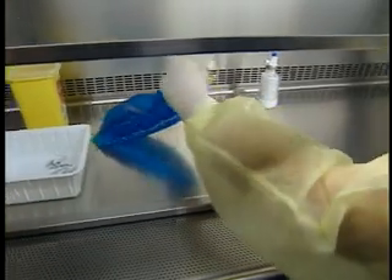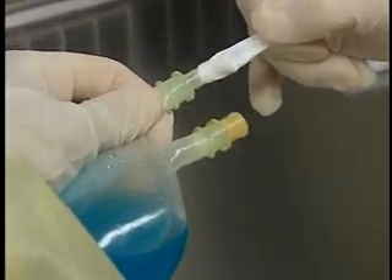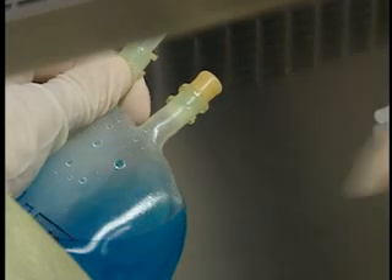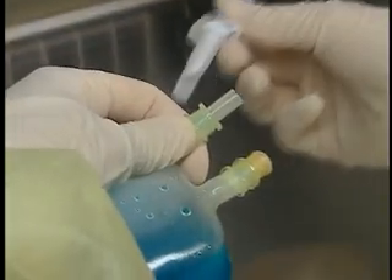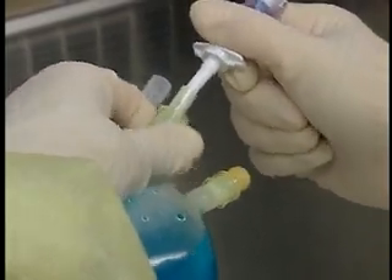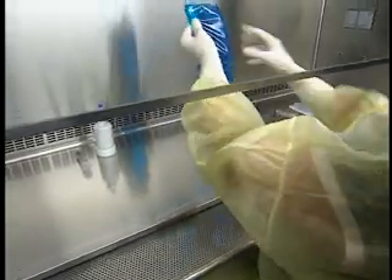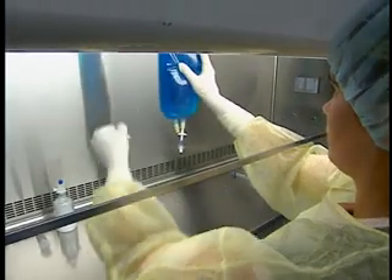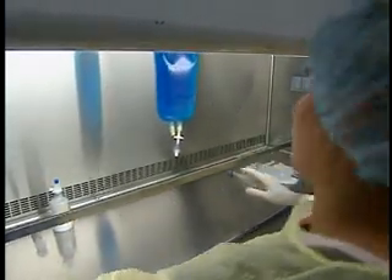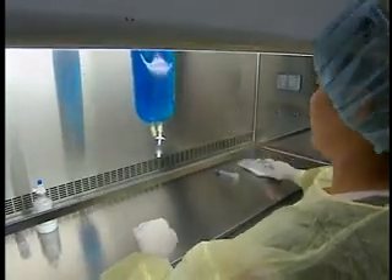Remove the plastic protector from the administration set port of the bag. Remove the protector from the spike, taking care not to contaminate it. Insert the spike in deeply, turning it as you push. Keep the administration set port of the bag two and a half centimeters from the work surface throughout this operation. Hang the solution bag in the center of the hood. Remove the protector on the transfer device if there is one. If the connection site is not protected, disinfect it with an alcohol swab.